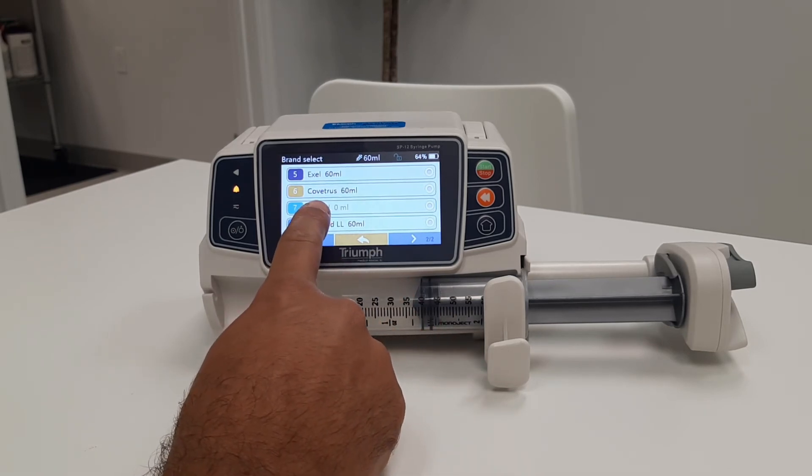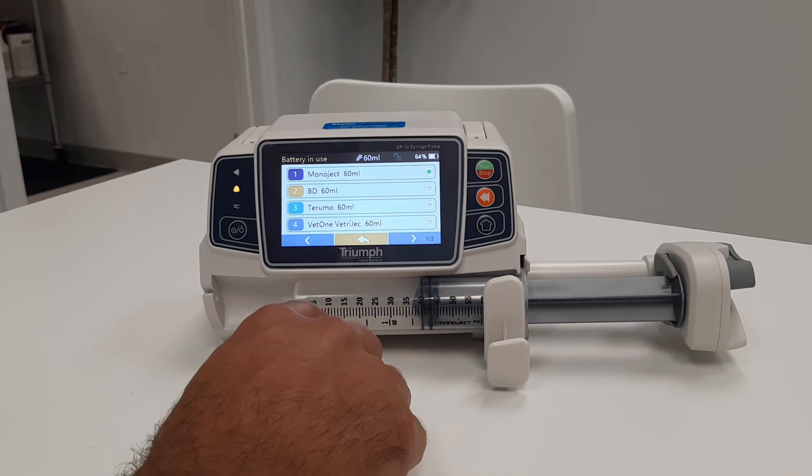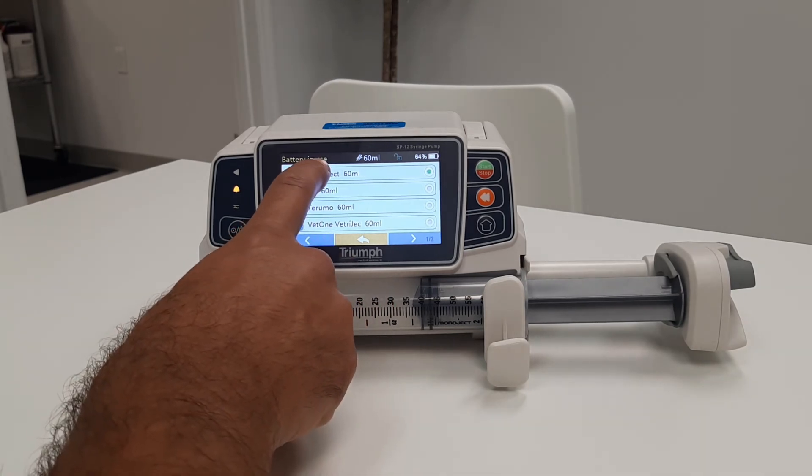Notice some manufacturers are grayed out. This is either because the plunger is too short and is not accepted by the pump, or the manufacturer does not simply make that size of syringe. In this case, we'll verify that we're using a Monoject 60.